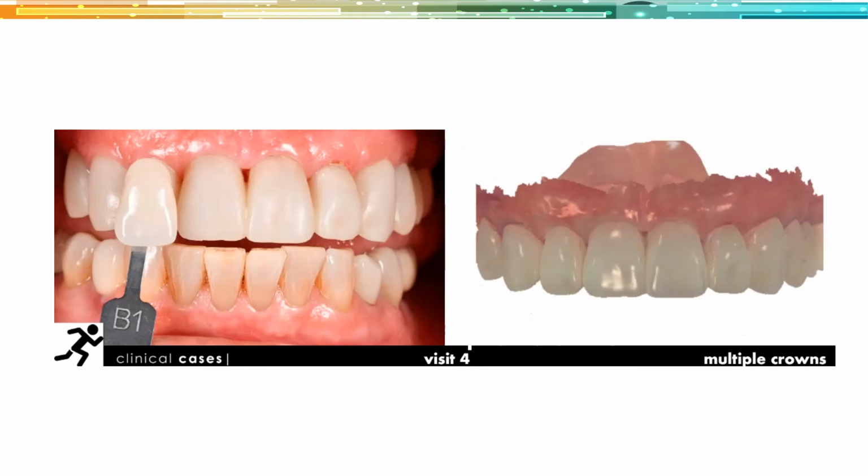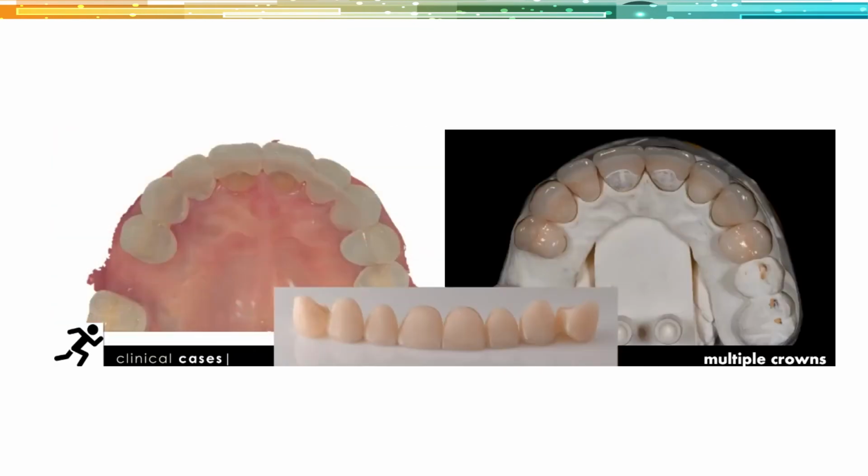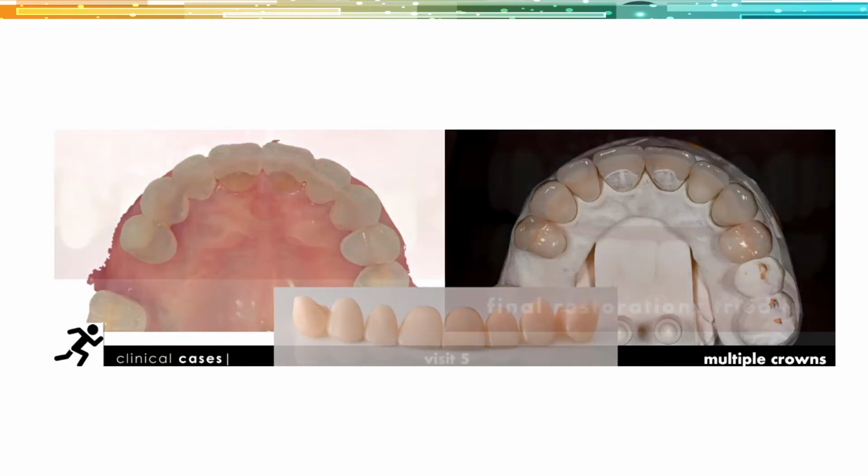And then they're going to align this scan to the other scans that I did. That's how they're really going to copy the contours that we've worked hard to design and make in the patient. And so you can see here, we asked for layered Emax in this case on the right-hand side, and the laboratory respected and reproduced the basic contours and size and shape of the provisionals.